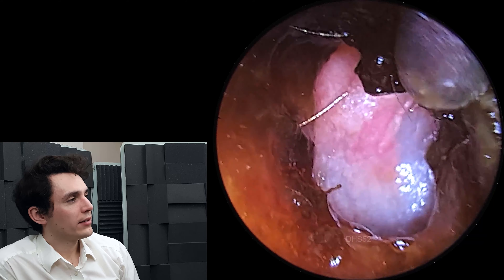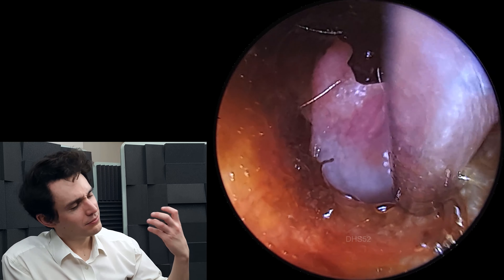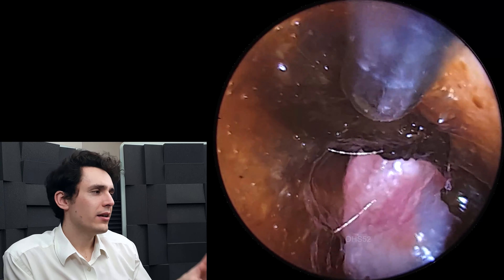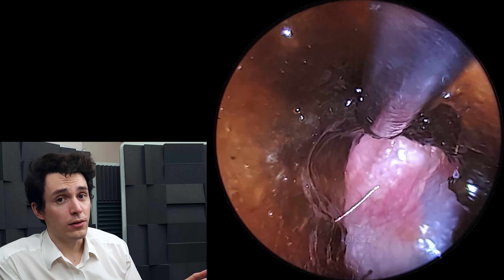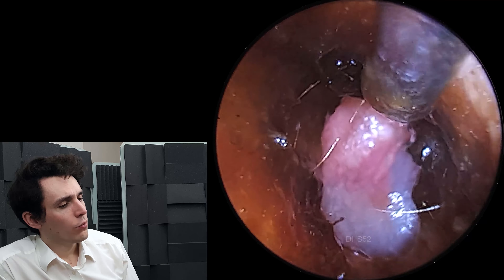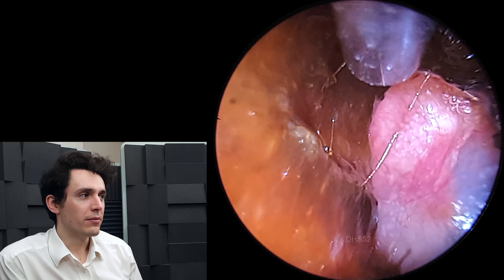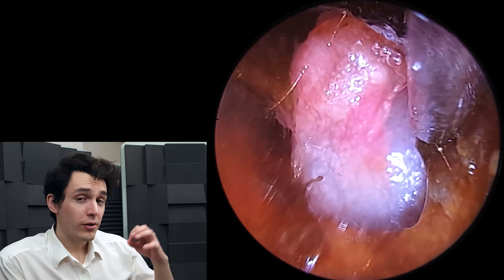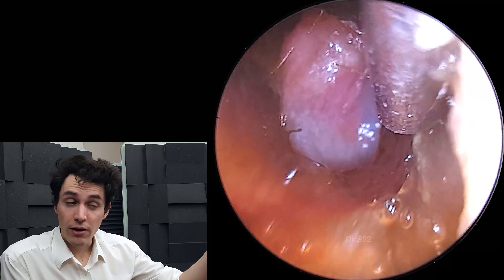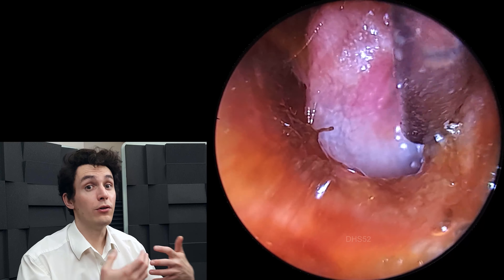Just look at how easy the wax is to hoover up now — such a difference from the first consultation where we were dealing with very tough molasses, chewing gum consistency, tar. And now it's just as easy as anything. The reason I always advise olive oil between consultations rather than sodium bicarb or hydrogen peroxide is that in my experience, whenever I've recommended sodium bicarb, the remaining wax kind of liquefies and goes right down to the eardrum and slicks up against it. I don't find that with olive oil — the wax actually tends to move forwards a little bit, laterally outward.